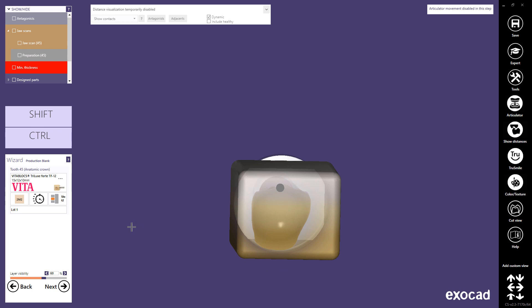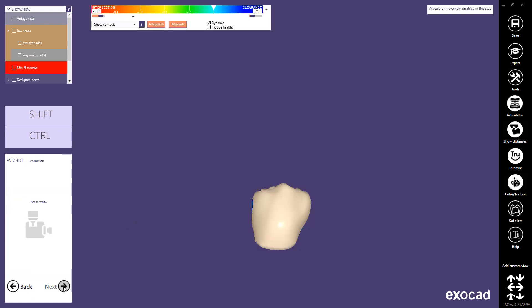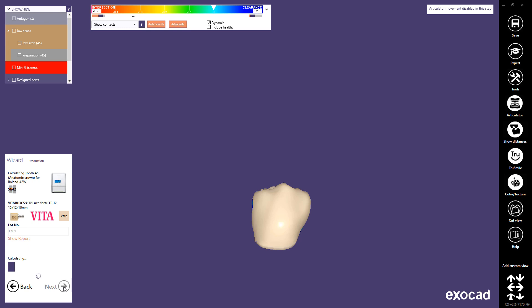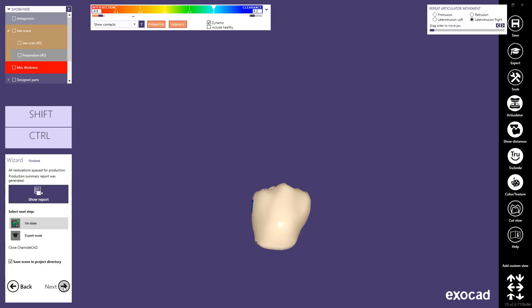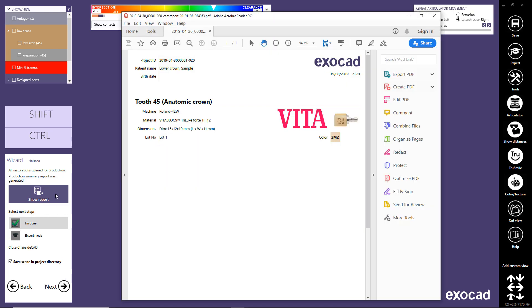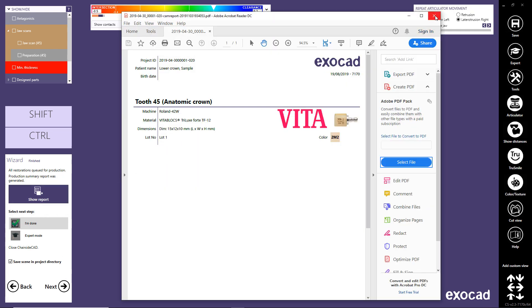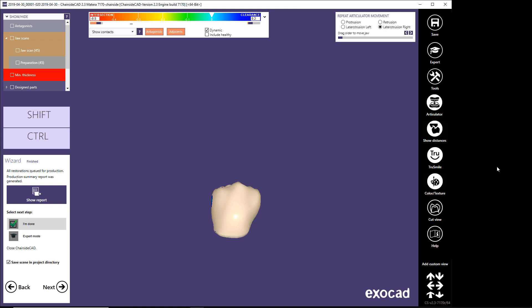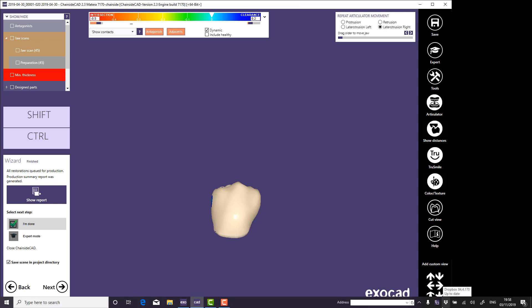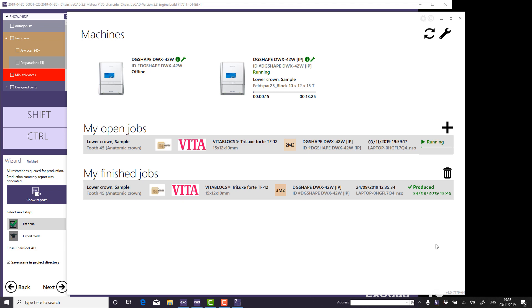Click Next to initiate the production step. Once the toolpath calculation is complete, the Chairside CAD workflow is finished. The restorations you have created are queued for production and a PDF file containing the production summary report is generated. Machine Tray Tool is a software application for storing, scheduling, displaying, and transferring dental CAM jobs — it allows you to control the assignments and the production queue to individual machines from your computer.